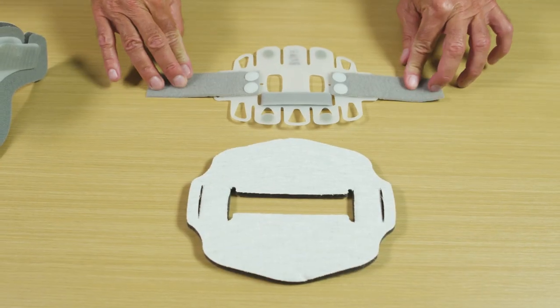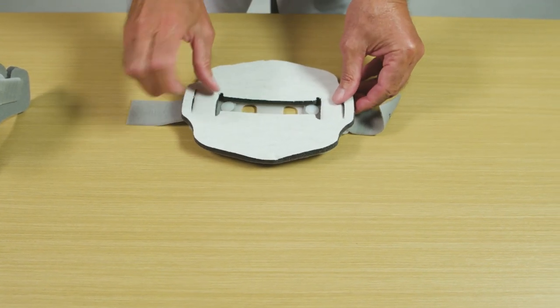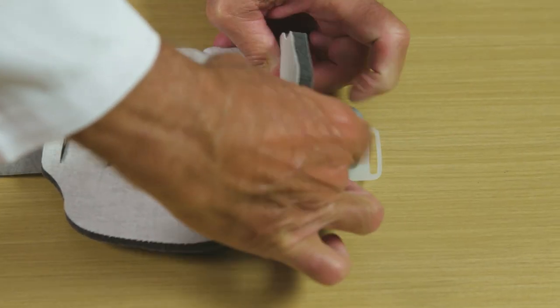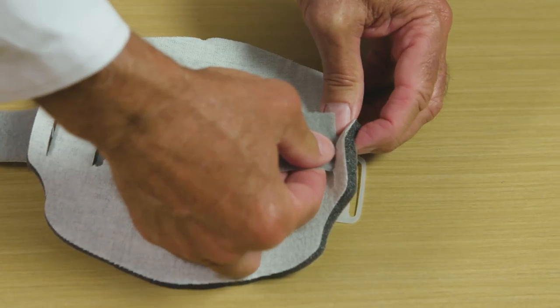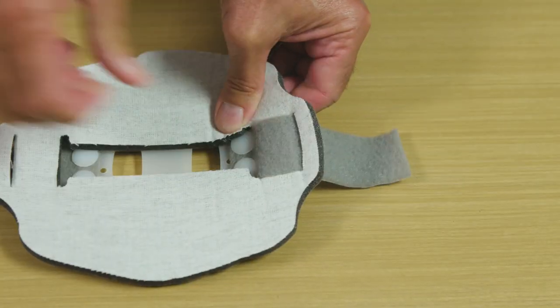The back panel pad is applied in a similar fashion. Place the back panel on a flat surface, align the replacement pad as shown, and press downward. Loop the hook and loop strap under and then through the slot of the back panel. Repeat this process with the other strap.